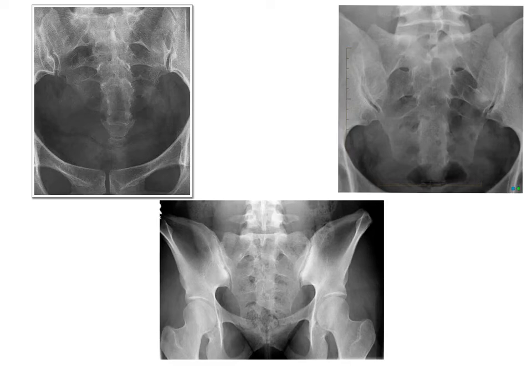Today we are going to review our sacrum, coccyx, and SI joint projections. What you will see on your screen in front of you are our AP axial projections. If you look to the left-hand corner, you've got coccyx, AP axial coccyx. Our right-hand corner, I'm going to put an S. This is for our AP axial sacrum. And the projection at the lower portion of your screen is going to be the AP axial SI joints.